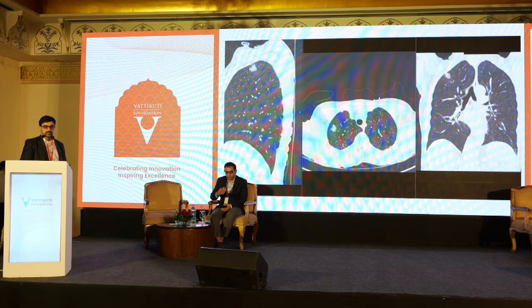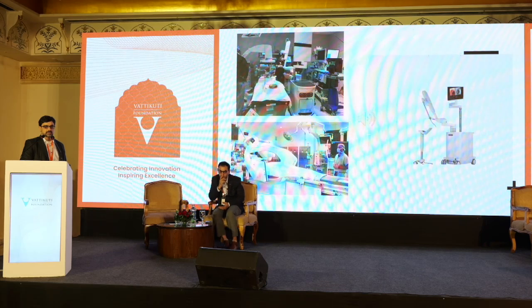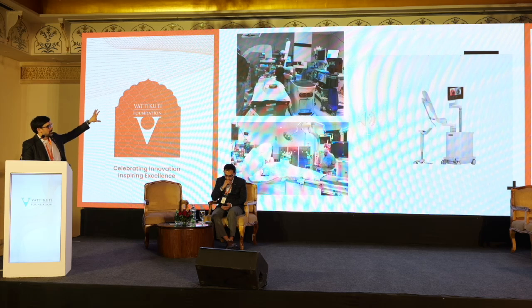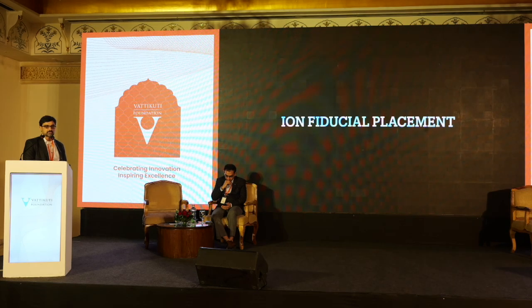So I'll go straight to the video. In this video, you'll see the operating room setup that we have here. The bottom left video shows our cone beam CT that we use intraoperatively. That's on a mannequin. And then the top left is our endoscopy suite, also with a cone beam CT. On the right is our ION robotic bronchoscopic platform. So I'll go to the video.